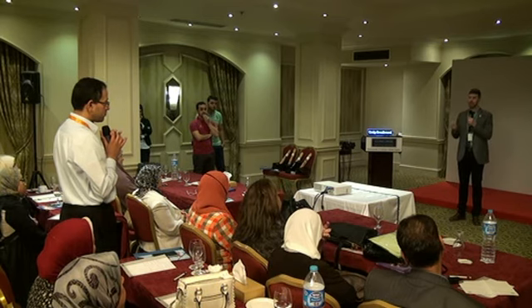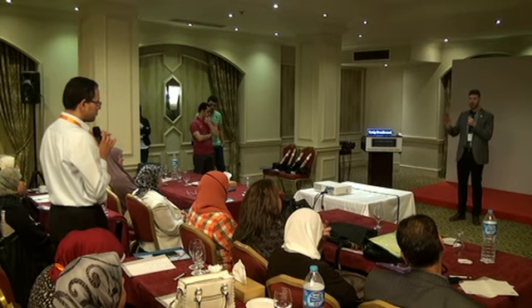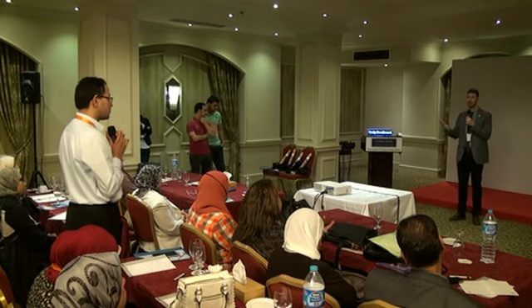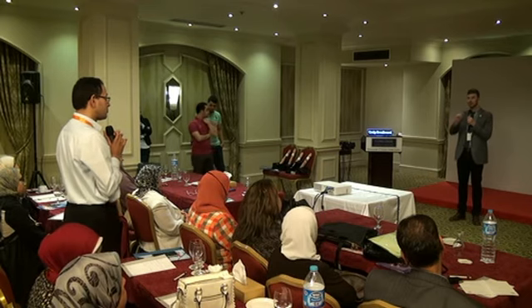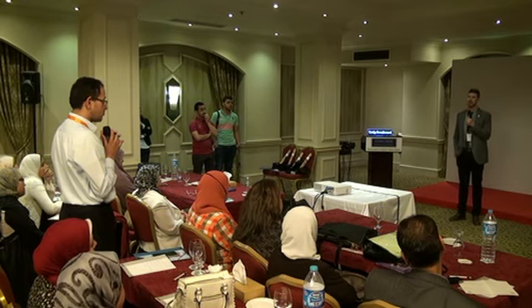And so that interpretation, that ability to look at whether it be obstruction or rebreathing or spontaneous inspiratory efforts during exhalations, dyssynchrony, stuff like that, you should be able to detect those shape changes. But the important piece would be understanding that there's going to be a larger discrepancy because you're underestimating the end-tidal in the case of a leak.